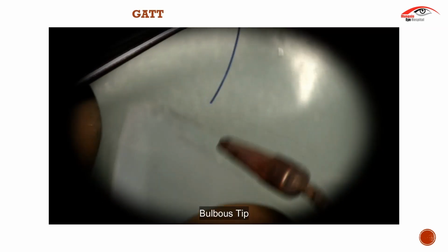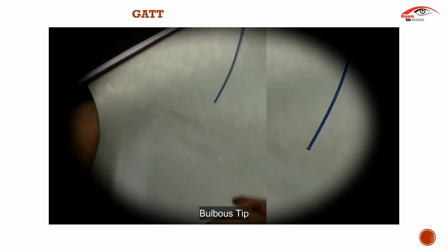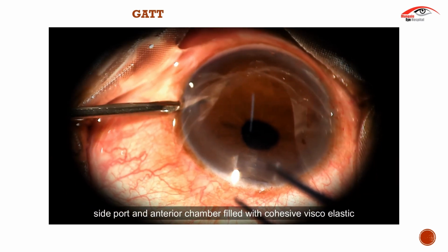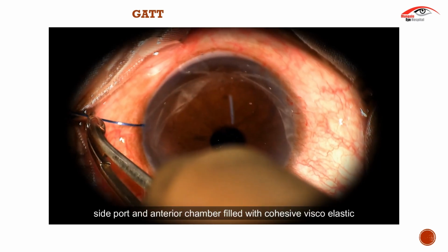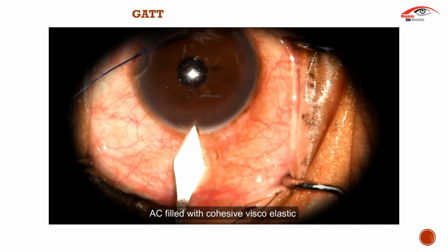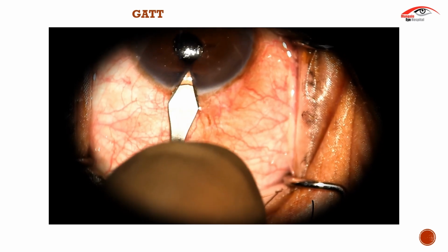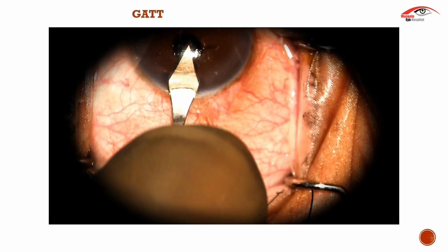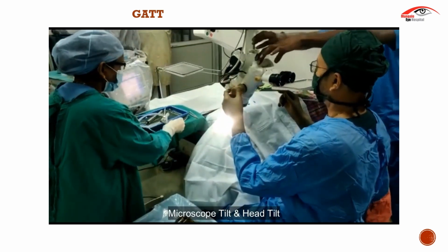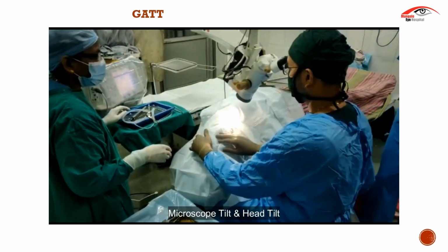The GATT surgery starts with the creation of a bulbous tip of a 5-0 Prolene suture. This suture is inserted through the side port. For better visualization of the angle, head tilt and microscope tilt is given.